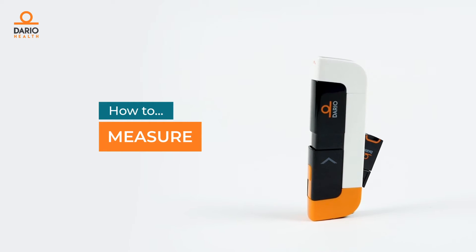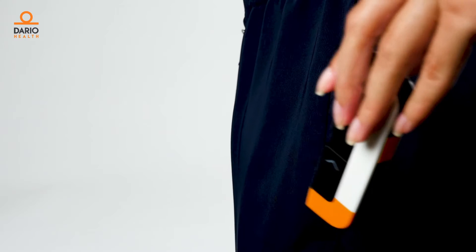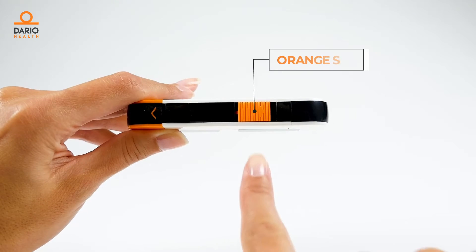It's easy to measure with your Dario smart meter. Just take it out of your pocket and pull out the meter by releasing the orange slider.